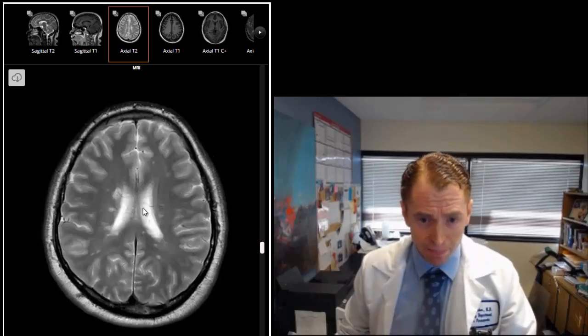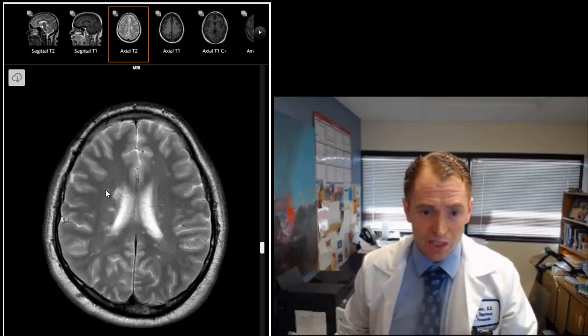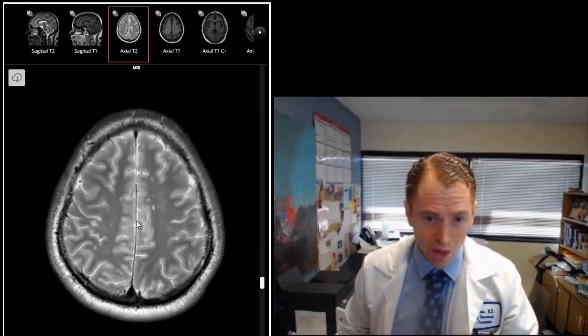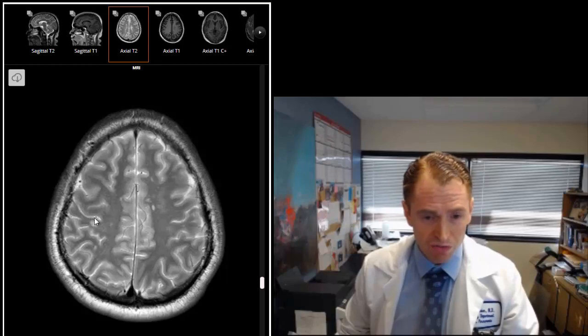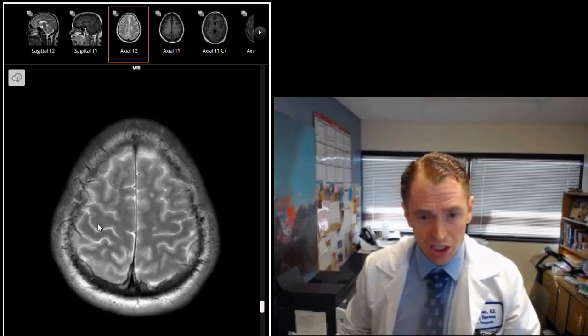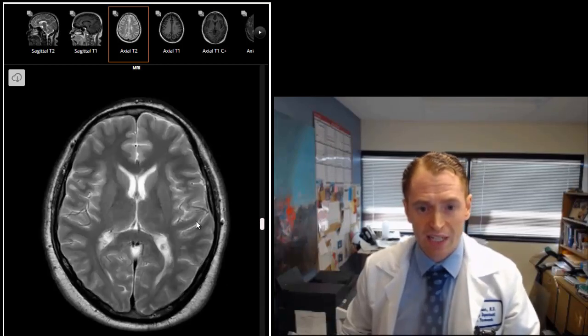We see a lot of lesions in the periventricular area. These are Dawson's fingers. We see lesions in the subcortical white matter. We see some lesions right next to the cortex called juxtacortical lesions. These are all classic MS lesions.